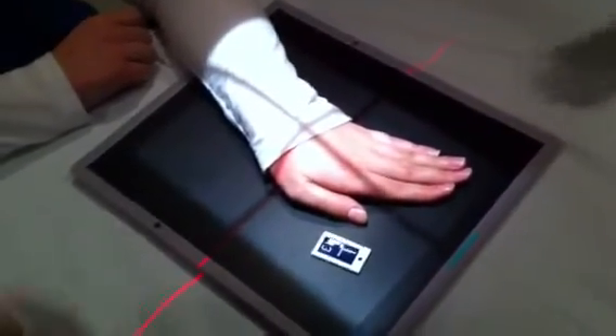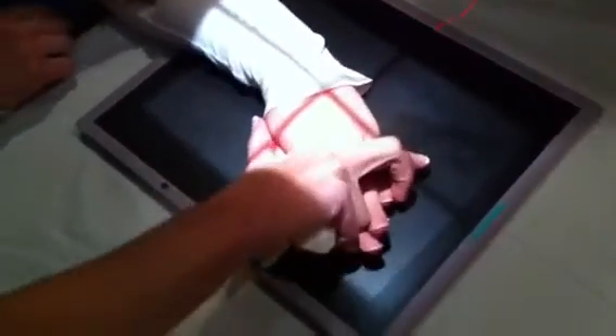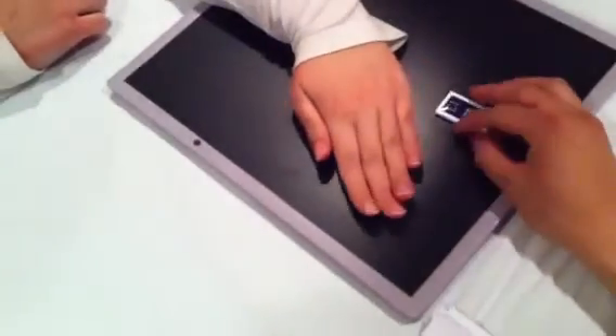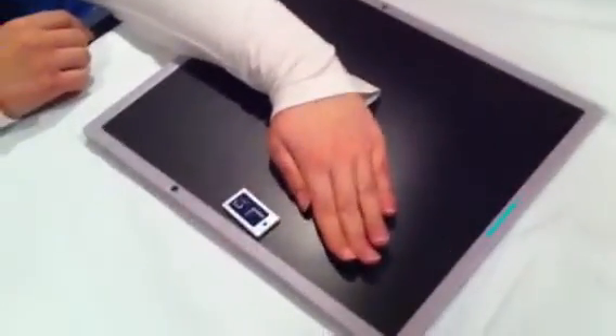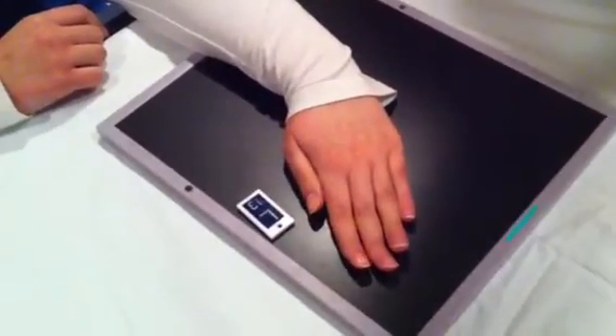Radial deviation — turn until the wrist is in extreme radial deviation. The IR is perpendicular, centered over the mid-carpal area. Your centering point is a little different, but not much.